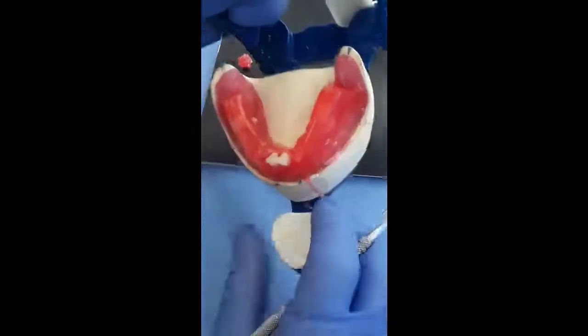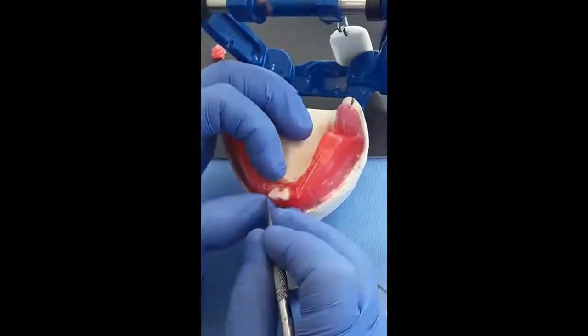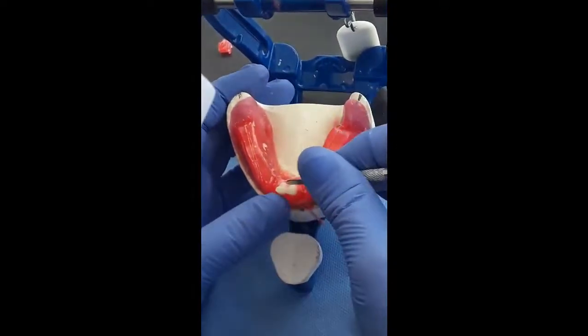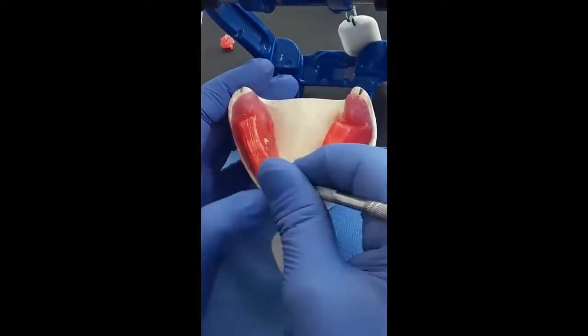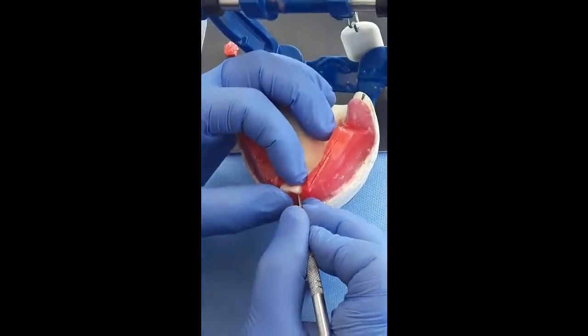Now, using a cold instrument, I can adjust the teeth. Now the curvature of the arch must be established from this stage so I will not get a flat setting.